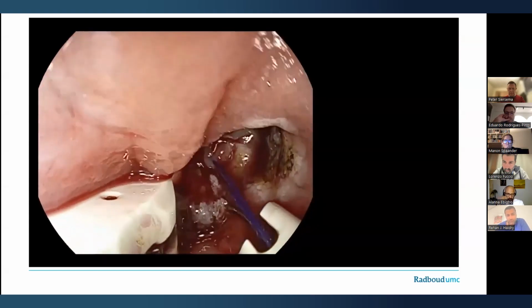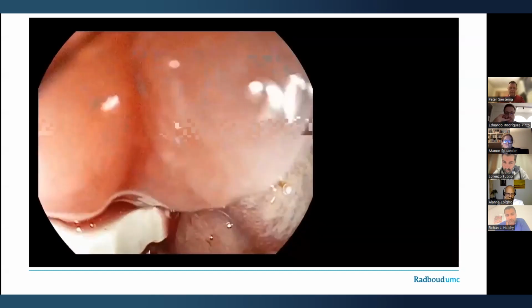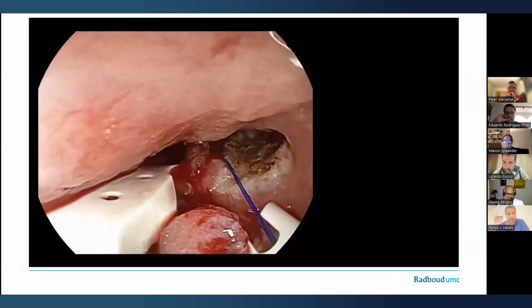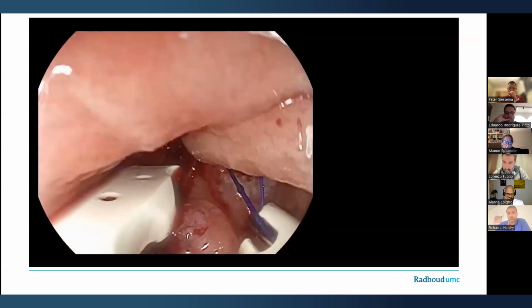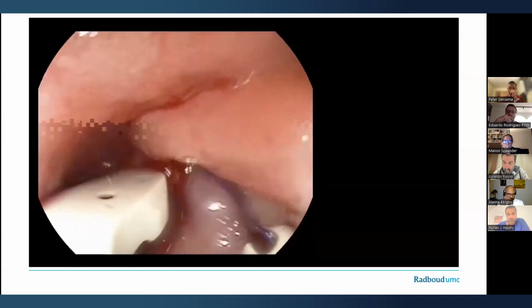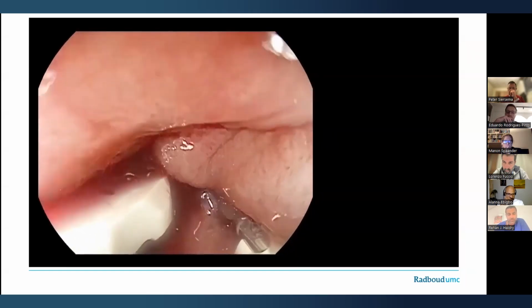And so it's really important to have a plan here as to what your suture pattern is going to be, and you can see that I've actually mounted the device differently from what we would use for other applications. So the needle drive is coming from the 9 to the 3 o'clock position. And that allows me to use a zigzag pattern to try and oppose the tissue and place my first suture to try and get closure.